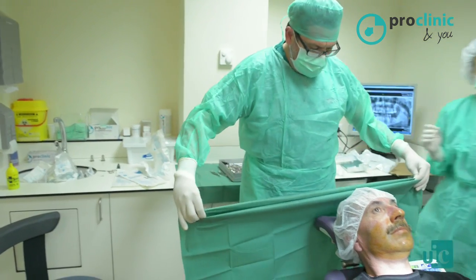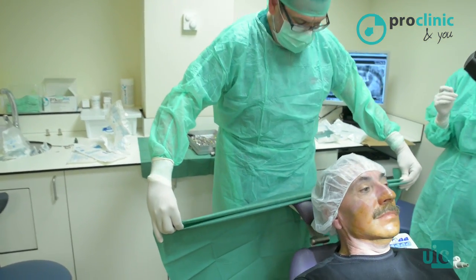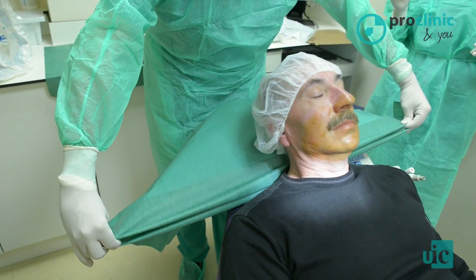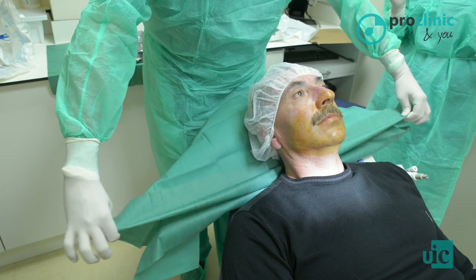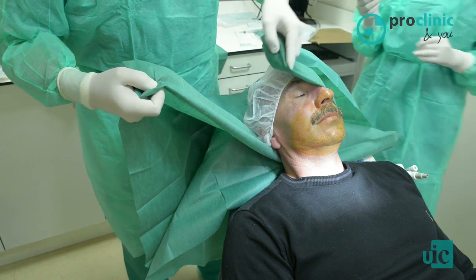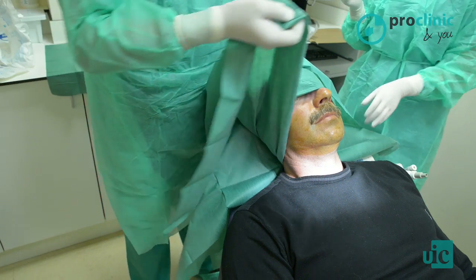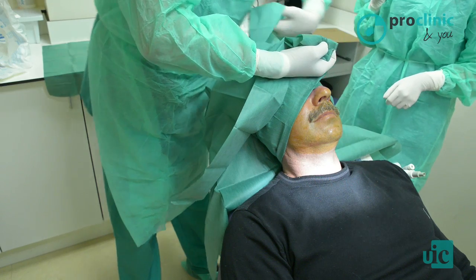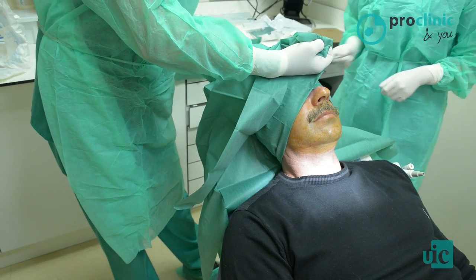We ask the patient to raise his head. Then we put the towel underneath his head. And finally, we ask the patient to go down, and we fold the towel to cover his eyes. One fold here, and another fold there. We are only touching the sterile parts of the towel. This is sterile.